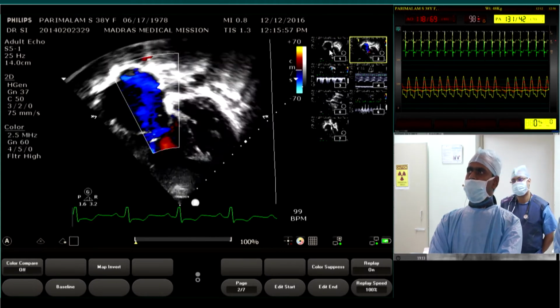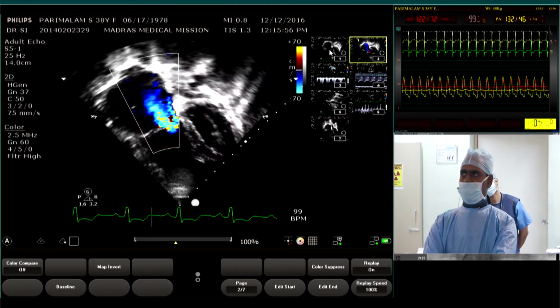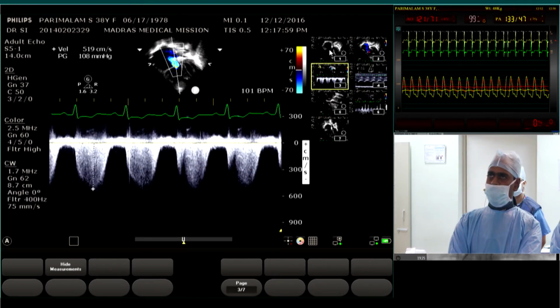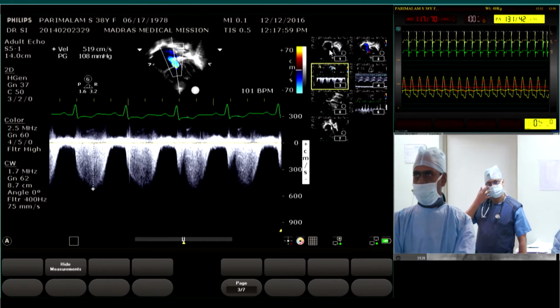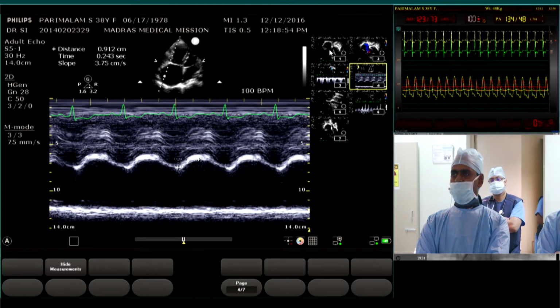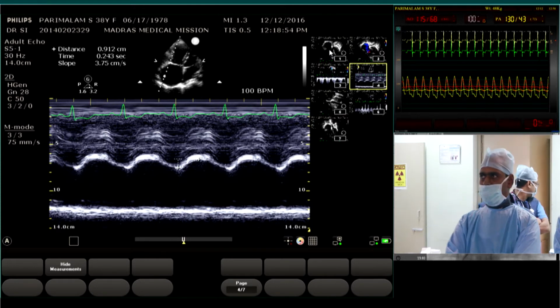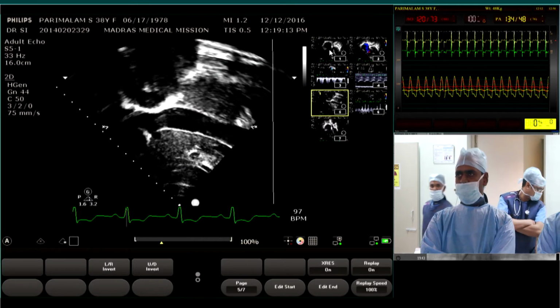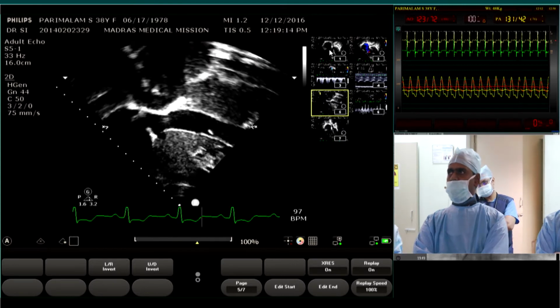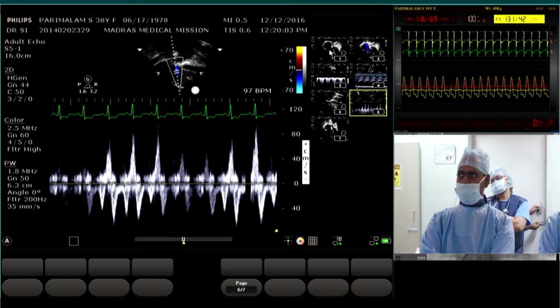Next. The echocardiography with the color Doppler shows significant tricuspid regurgitation, and when we measure the tricuspid regurgitation jet, it is around 108 millimeters of mercury, and when you do the TAPSE assessment for the tricuspid valve M mode mobility, it's 9 millimeter, indicating significant RV systolic dysfunction. The inferior vena cava is markedly congested. There is no inspiratory collapse, and the hepatic venous flow Dopplers are showing very prominent atrial systolic reversals.